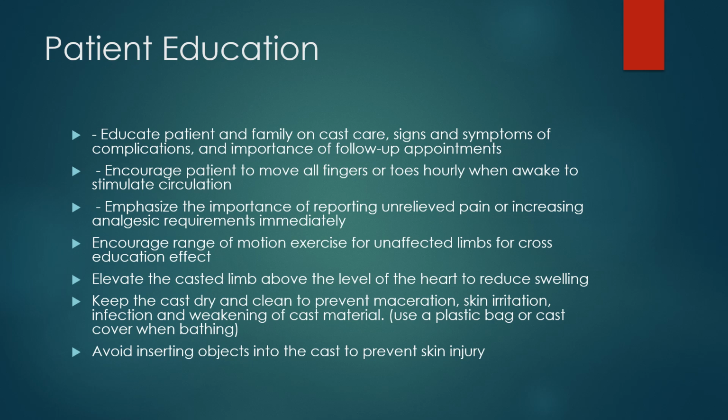Then you have to keep the cast dry and clean. And this is related to the plaster cast because it's not water resistant, to prevent maceration, which is skin breakdown, then we have skin irritation, infection, and weakening of the cast material. And in case you have to bathe, especially relating to the plaster cast, you use a plastic bag or a cast cover to cover the casted area before bathing.